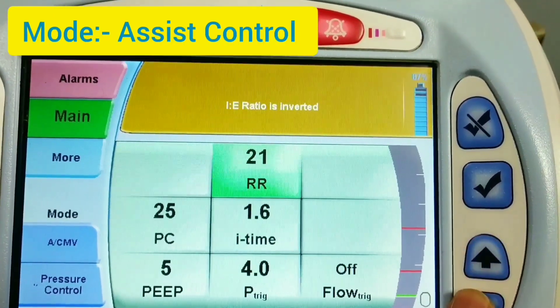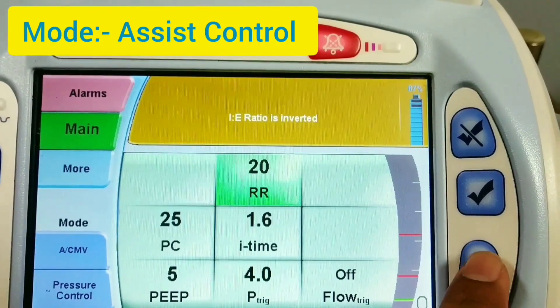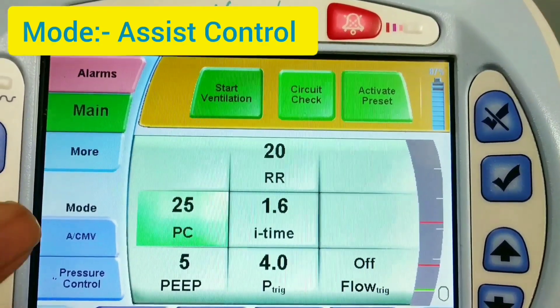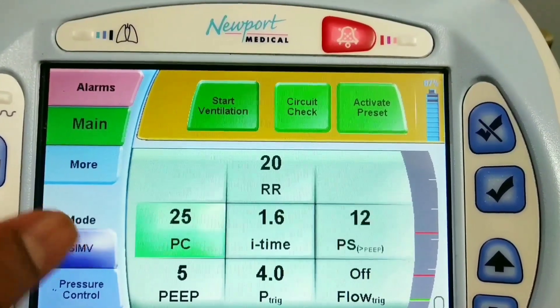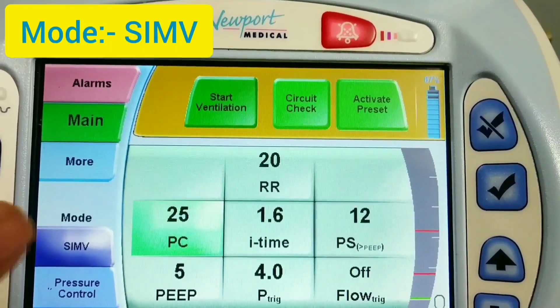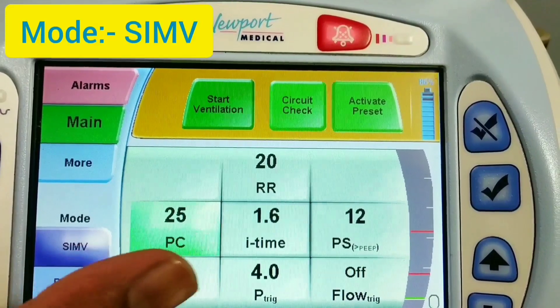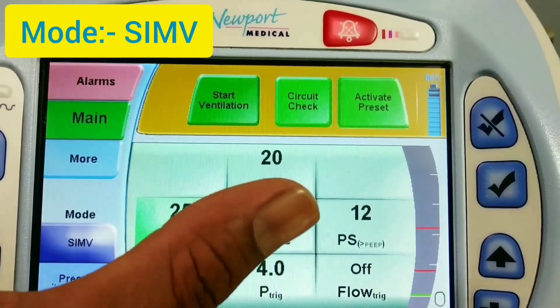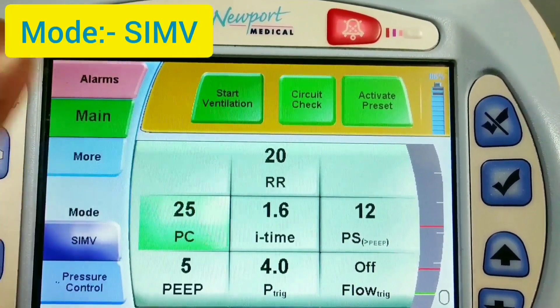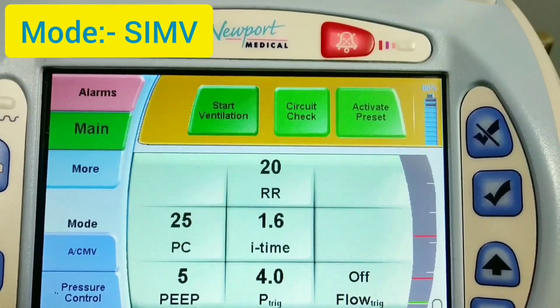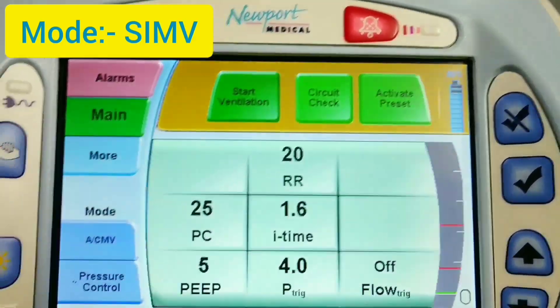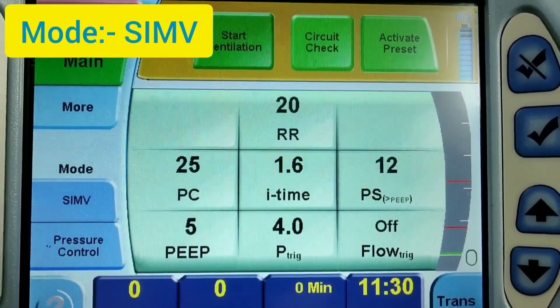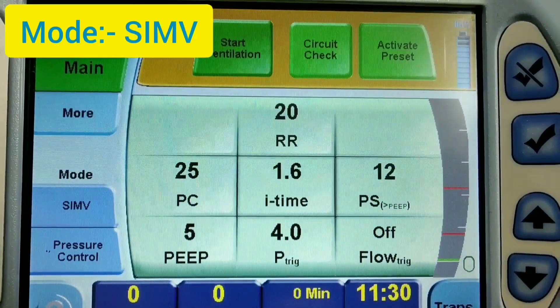If you want to change any parameter, just touch it and use the up/down keys. The pressure control can be set — for example, 25. Another mode is SIMV with pressure control breath type. The adjustable settings include rate, pressure control, PEEP, and I-time. Again you have to tick mark and save; otherwise it will revert to the previous setting.